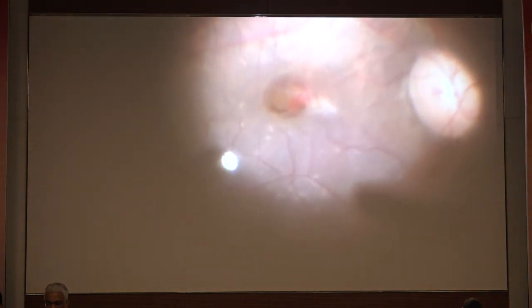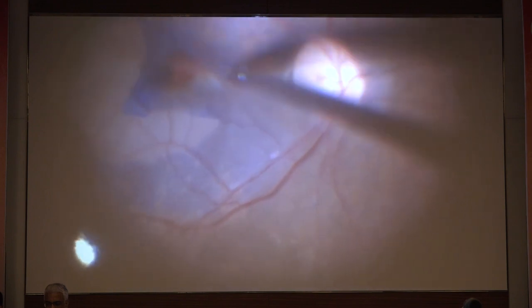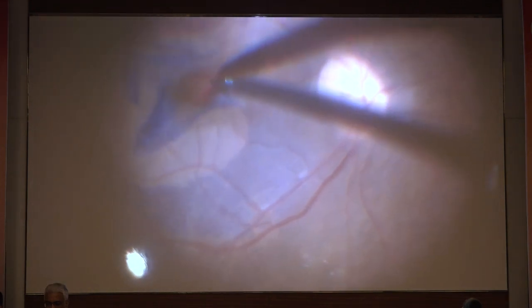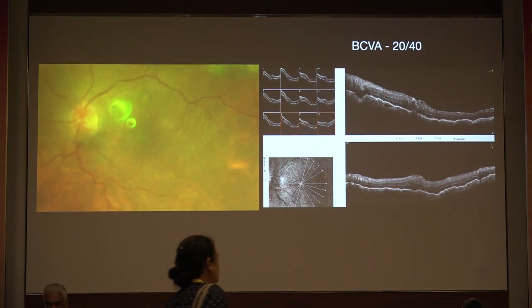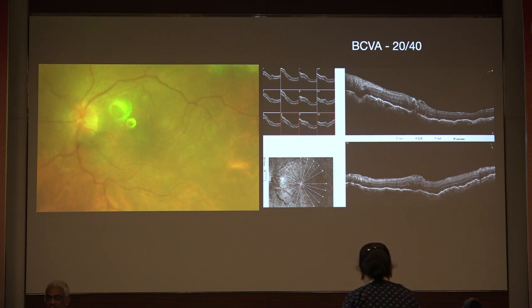So I removed this subfoveal PFCL, and the PFCL bubble was nicely removed. But you have to tackle this foveal tear. So I stained the ILM and tried to cover this foveal break with an ILM flap, and covered the whole foveal tear, because I was not sure whether it had created a foveal tear or not. But still, when the subfoveal PFCL had come out, that means there was some breach in continuity of the retina. So finally I could save my face in front of the patient. Just see, there is no break and no subfoveal PFCL also. Thank you.